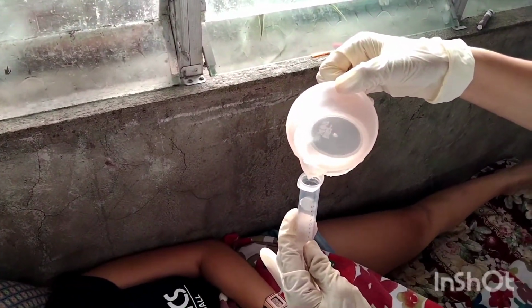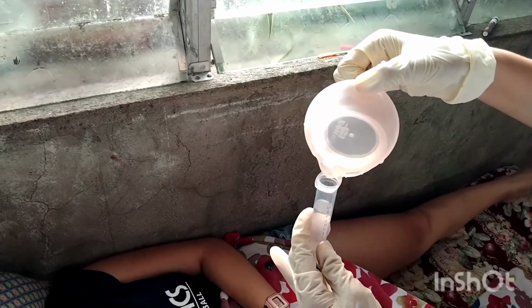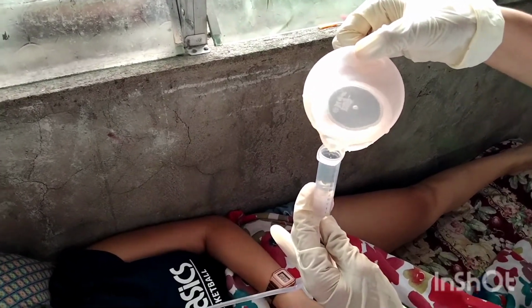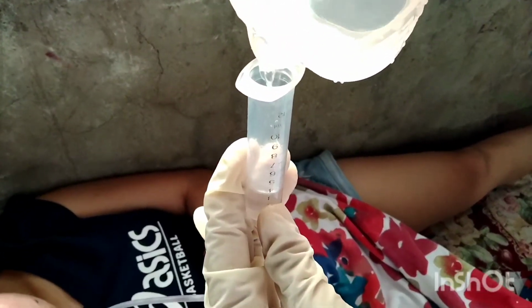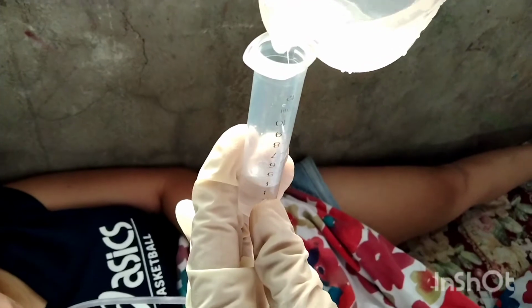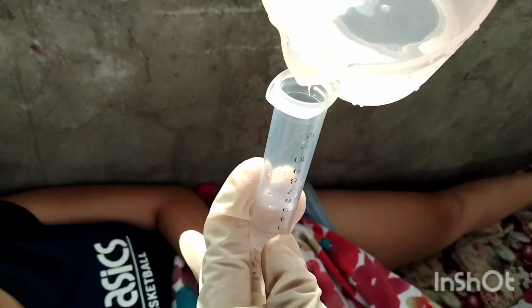Administer water via feeding tube as ordered with diluted formula. This provides client with source of water to help maintain fluid and electrolyte balance. Next is to rinse bag and tubing with warm water whenever feedings are interrupted. Rinsing bag and tubing with warm water clears old tube feedings and reduces bacterial growth.